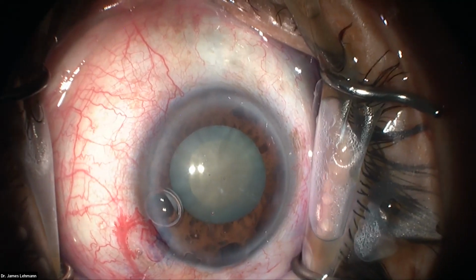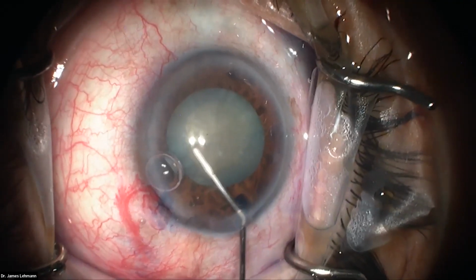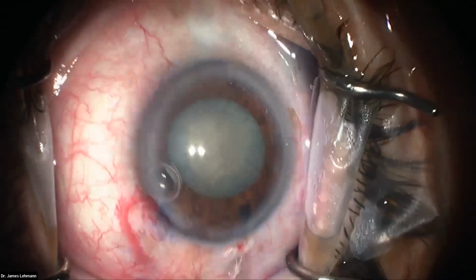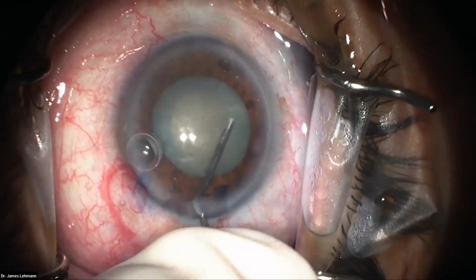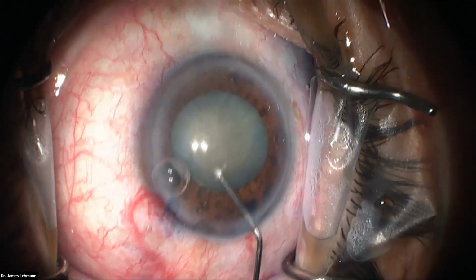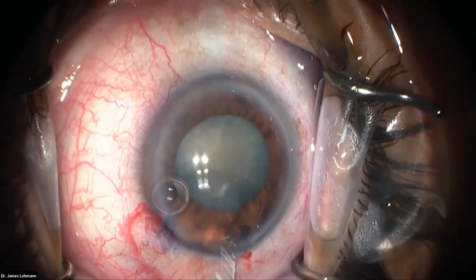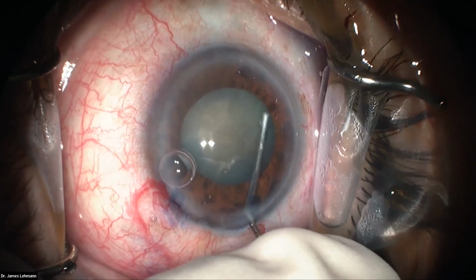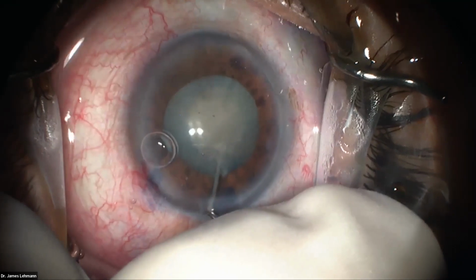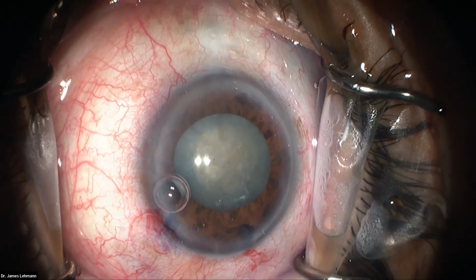And now here's that part about the hydrodissection. Now you don't always have to hydrodissect a mature cataract. I'm going to just put a little bit of fluid there. You can see stuff moving a little bit, kind of stuck down. And then just to see if we can spin it around a little bit. It's not moving great. I'm going to put a little bit of fluid. Okay, now we'll try to turn it. There we go. We're able to turn it. See, just with that little bit of hydrodissection.